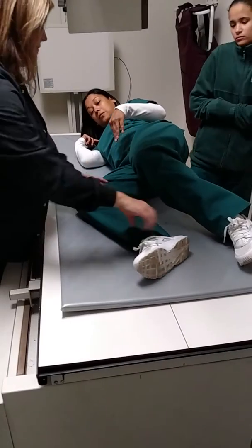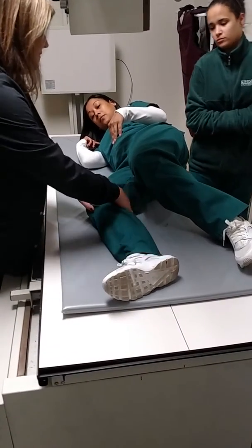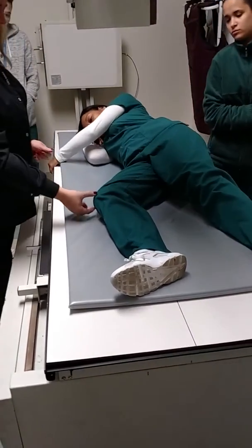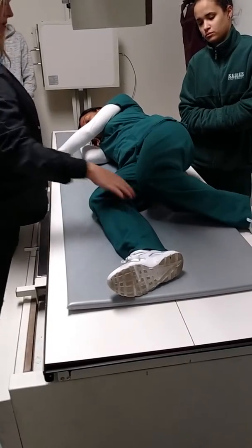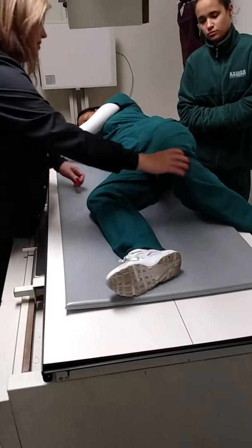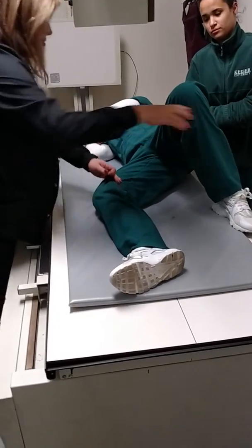Okay, we need a 45 degree bend, too much. There's 45. Get that one gone. Come down a little bit. Probably be easier to bend that leg and put your foot, there you go. Well, now this is on top of there. You're going to show us your crouch anyway, so you might as well start.